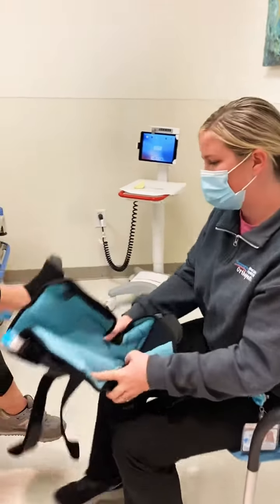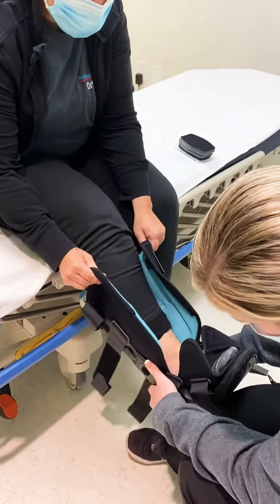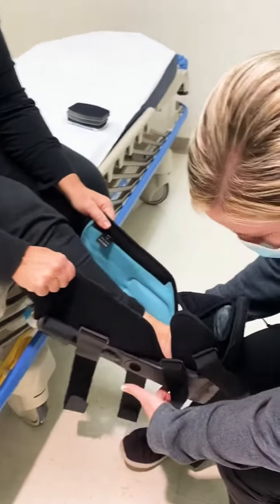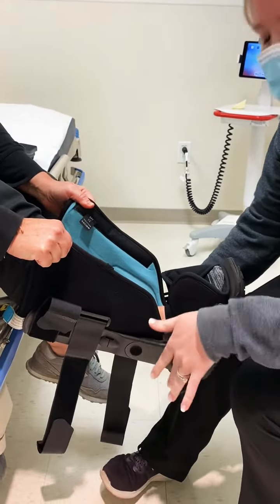Have the patient slide their foot in, bring their heel all the way down and back. You want to check in the back at the heel to make sure it's in there correctly, because you don't want the heel sliding around and getting rubbed.